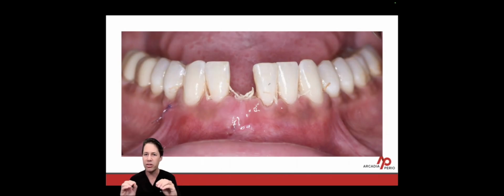I used a combination of two different suture types. I used resorbable glycolon sutures on my two vertical components, and then I used PTFE across the horizontal aspect of my incision. When I'm doing a case that requires good closure long term, I really like to use the PTFE sutures. Although I have to remove them, I think they hold up better and they expand a little bit with the swelling as things are healing.